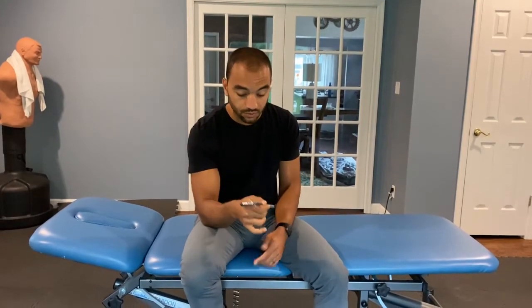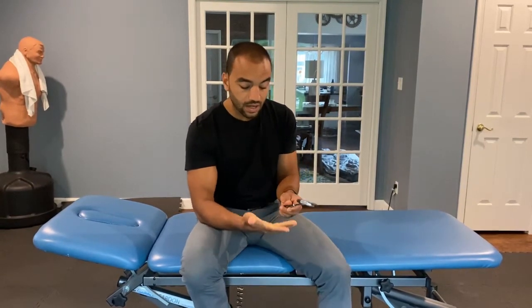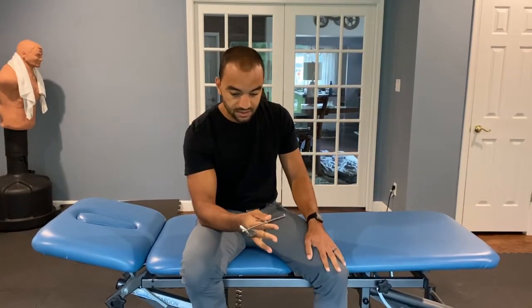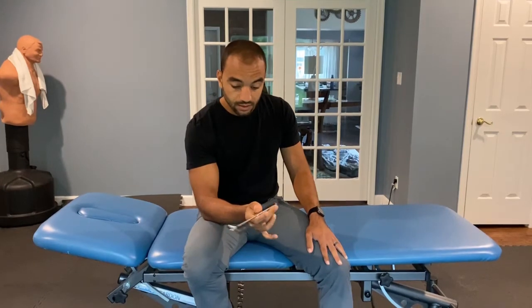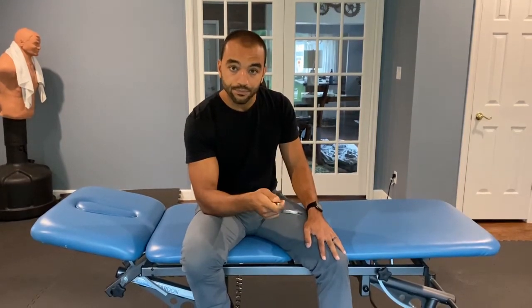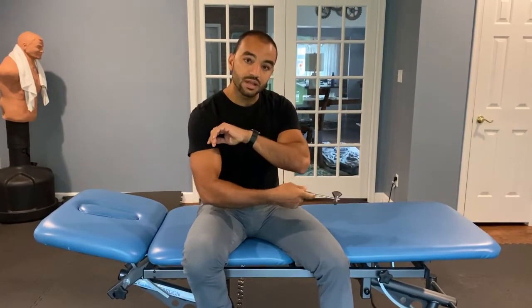In terms of technique with holding the reflex hammer, it's really important that you get the technique down and you learn how to flick the hammer with the wrist and the finger setup. So ideally, we're going to essentially balance the reflex hammer on the index finger so that it's basically just balancing here. Then I'm going to take my middle finger, and my middle finger is going to create a little flick maneuver, and then I'm going to superimpose a wrist flick at the same time. Okay? This testing can sometimes be painful, especially at the tricep and especially at the patellar tendon. So you don't want to be hammering with the elbow and the shoulder. So it's really just getting that flick of the finger and the wrist together.